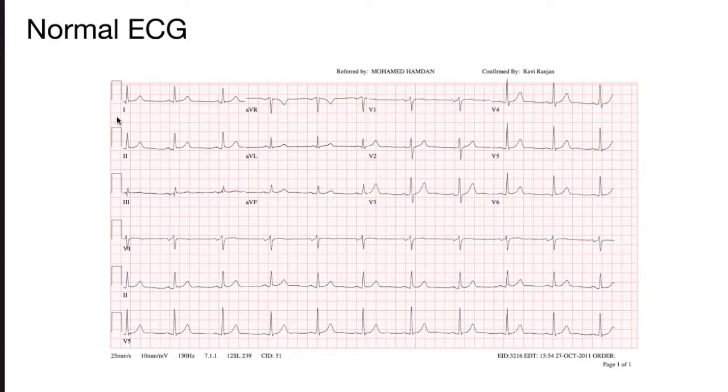Just to break down what you're looking at, so lead 1, lead 2, and lead 3, the 3 Einthoven leads. Right here you have V1, V2, V3, V4, V5, and V6. Those are the precordial leads. So you're looking at an individual section of all of them, and these down here are just longer rhythm strips of the leads. So you have V1, lead 2, which is an Einthoven lead, and V5. So, did you mention what the aV leads were?